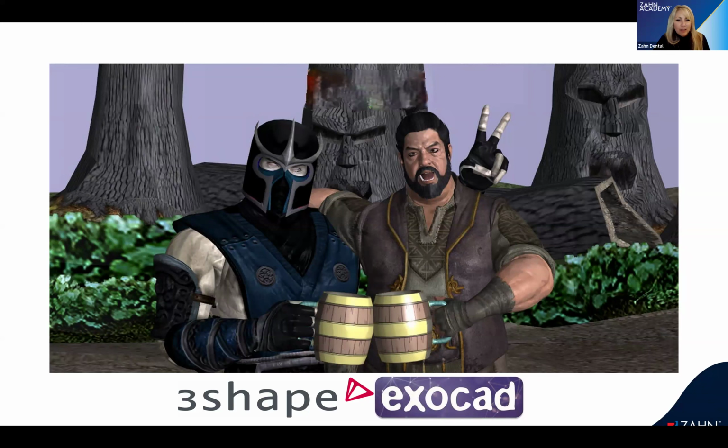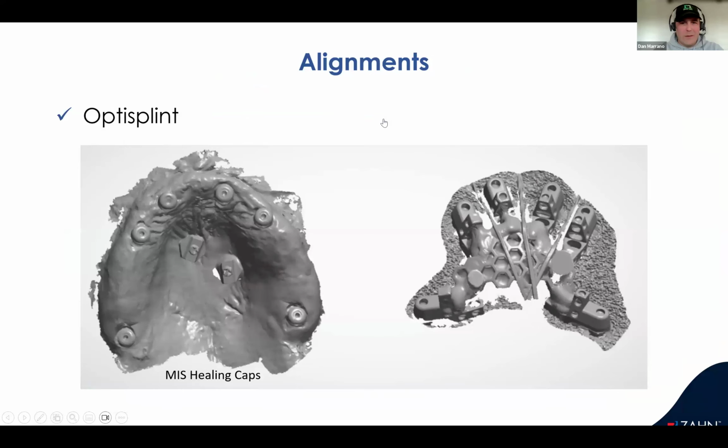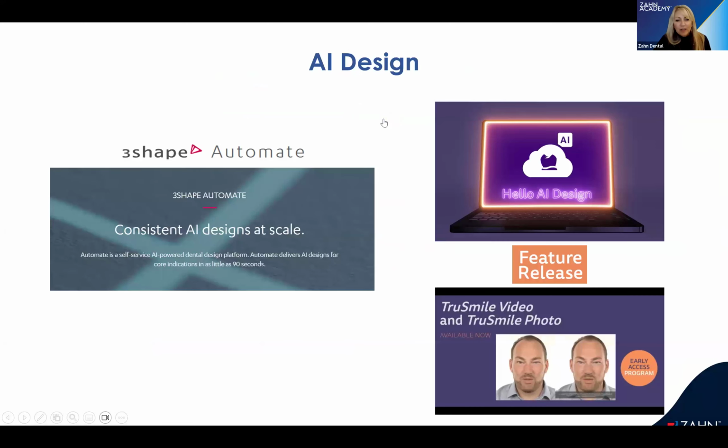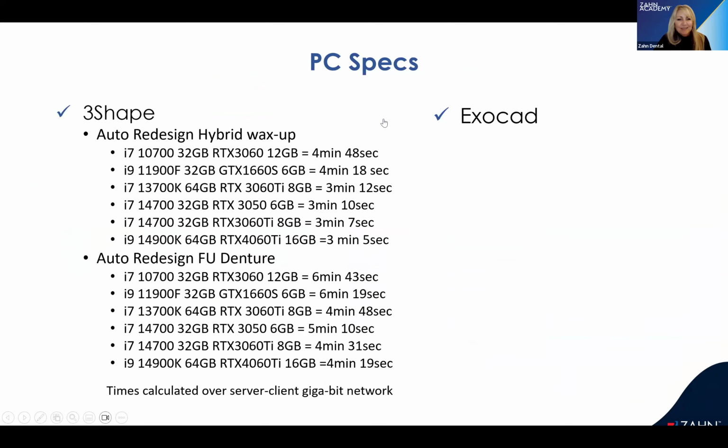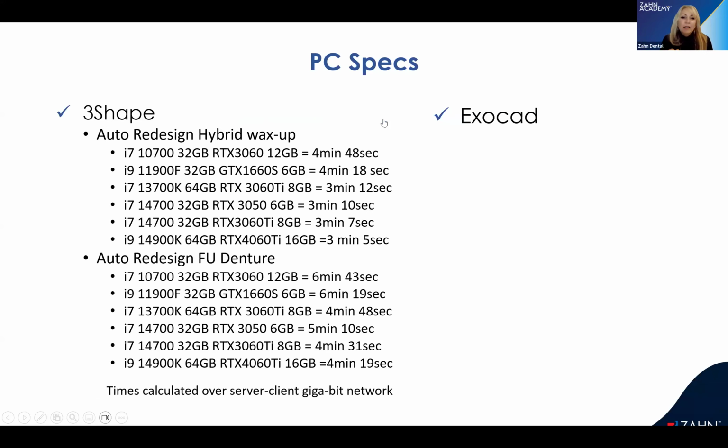And then we have Jared, and he wants to know if you can put up the slide of PC specs again and CAM calculation for us. Oh, sure. Let me go back. He wants to see that slide really quick again. PC specs, the big thing. Everyone's talking about it now. That was the CAM one we had. You want to take a picture of that, Jared? And this one here, if you want to take a picture, that's totally fine. You can kind of see where the gains start to fizzle out. You can find yourself somewhere in between there.